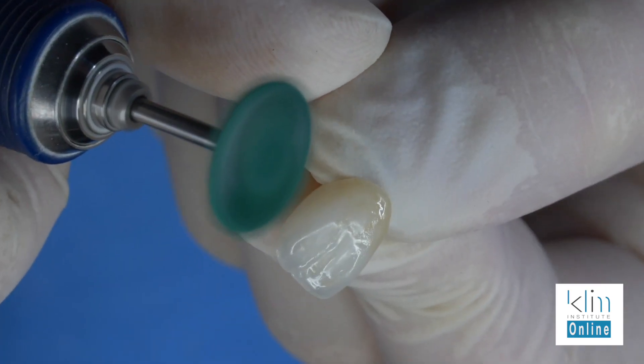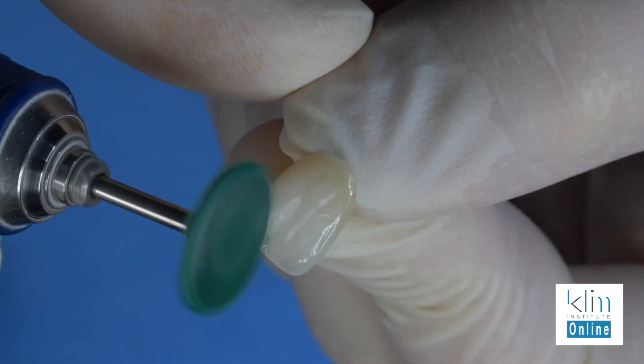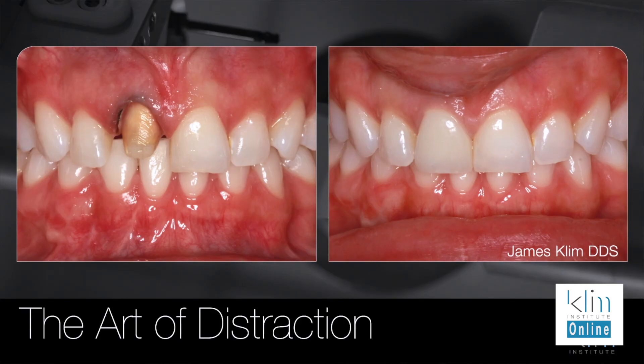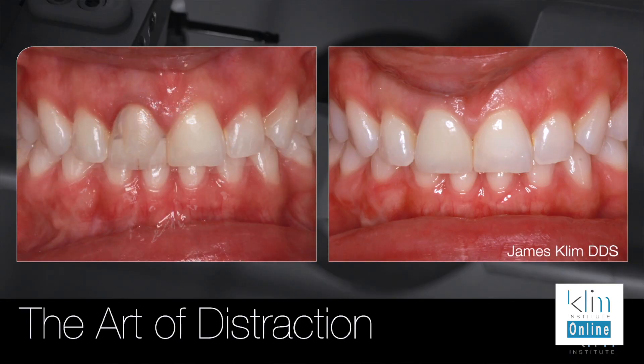One thing nice about Mio, particularly where we placed the structure over the colors, is that there's room to polish without polishing away any colors — and that's really nice. In most cases with my ceramics, I like to slightly over-texture, glaze or polish, and then polish in the luster you want. Not all teeth have the same luster in the mouth. The way to analyze that is to dry the teeth lightly — don't desiccate — and take photographs to get the reflection and the type of luster you're looking for.